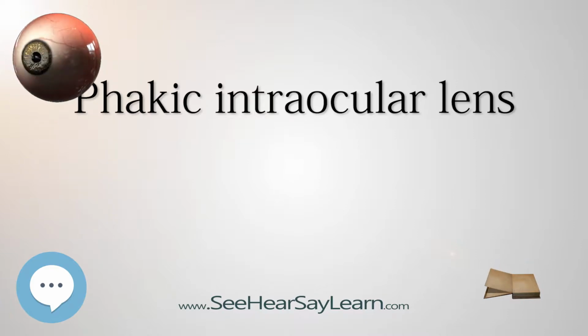Phakic intraocular lenses are indicated for patients with high refractive errors when the usual laser options for surgical correction, LASIK and PRK, are contraindicated. Phakic IOLs are designed to correct high myopia ranging from 5 to 20D if the patient has enough anterior chamber depth, ACD, of at least 3 mm. Three types of phakic IOLs are available: angle-supported, iris-fixated, implantable Collamer lens.